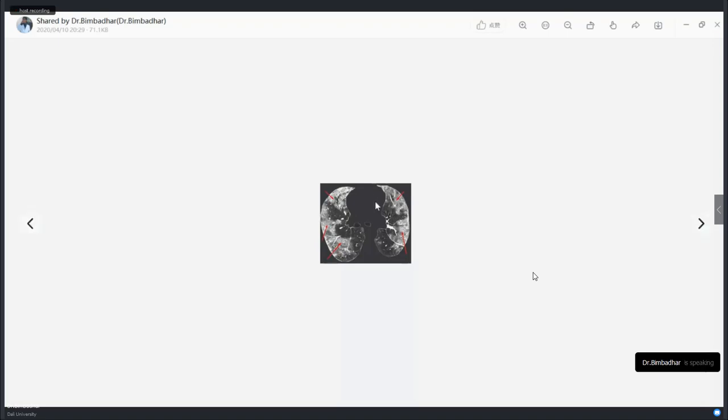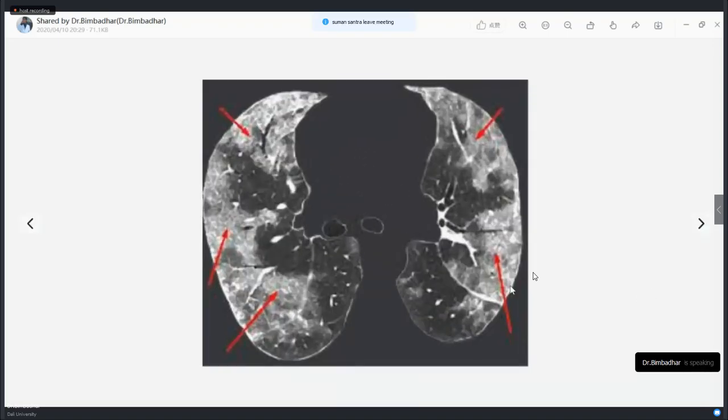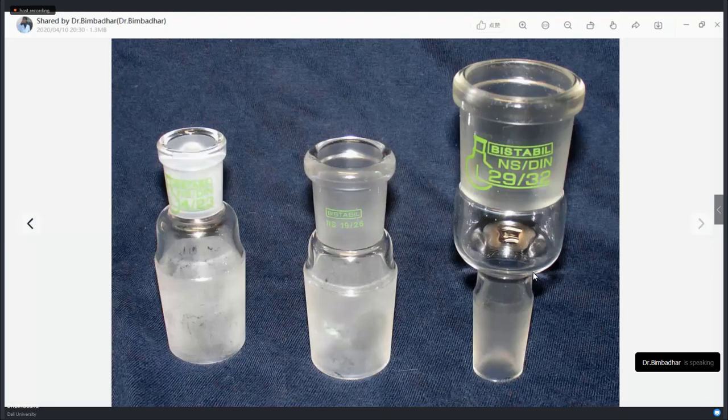This is the ground glass appearance. You see here, this is the ground glass appearance. They look so hazy. They look so bright. Compared to the completely transparent area of the glass present above, when you look below, it looks so white and hazy, right?